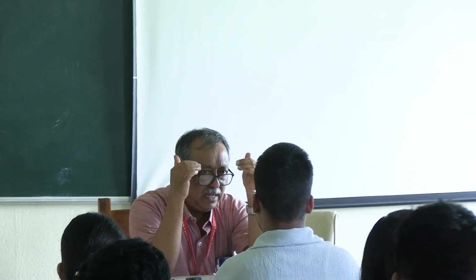On the intensity of the normal speech falls within that area. Better to say the phonemes, the frequency of the speech, normal speech, are placed in that area, the banana-shaped area.